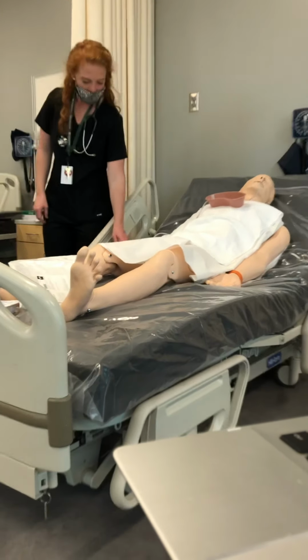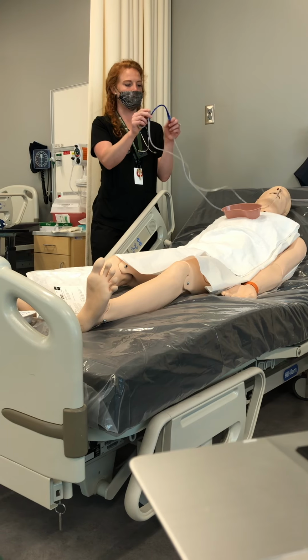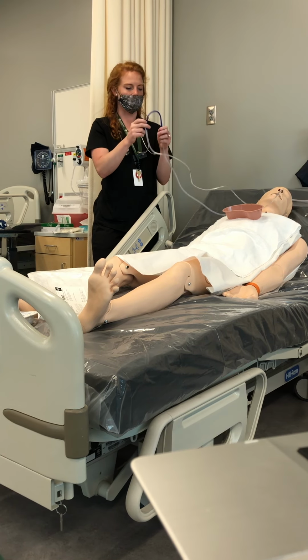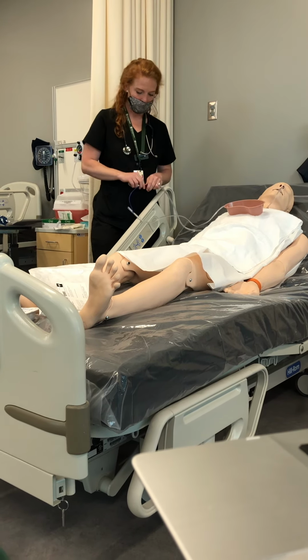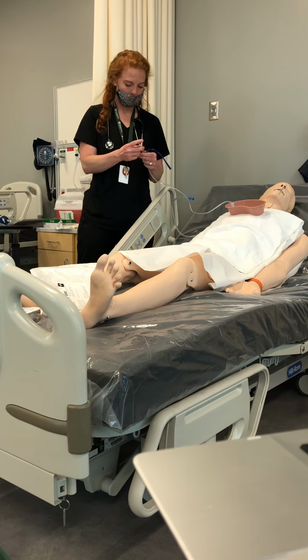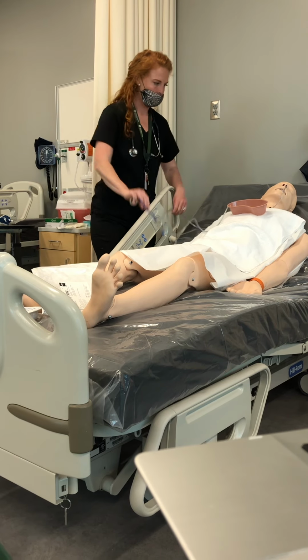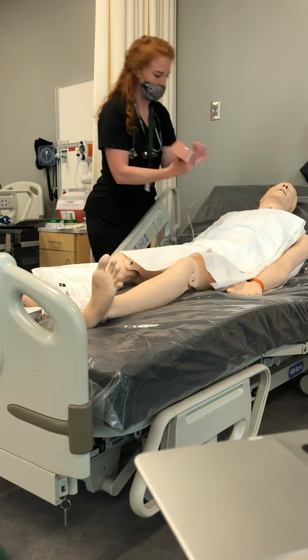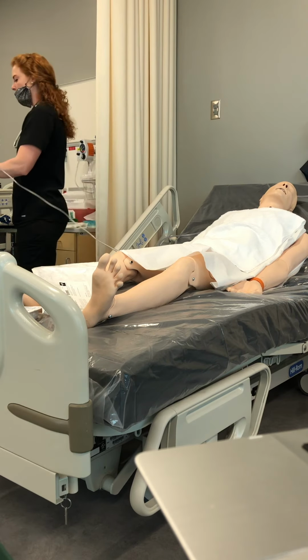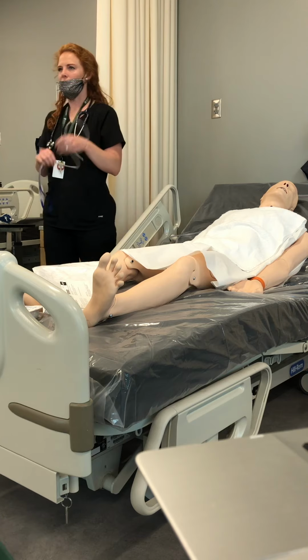At this point, typically there's a piece that will connect the catheter tubing to the suction, but we just don't have that right now, which is very unfortunate. So, okay. So I will undo this. We're going to reuse a lot of these supplies just because they're very easy to reuse.